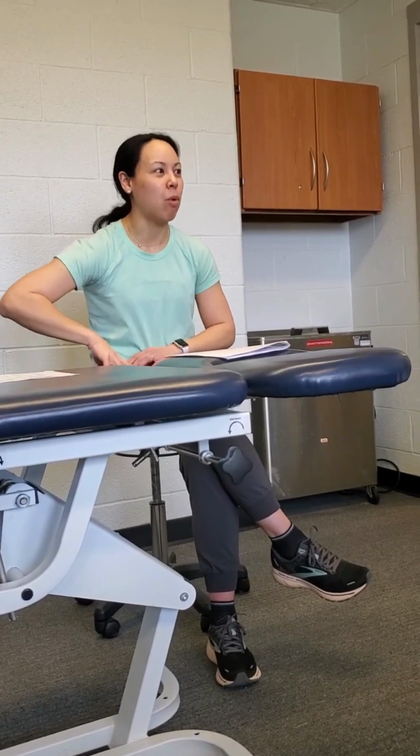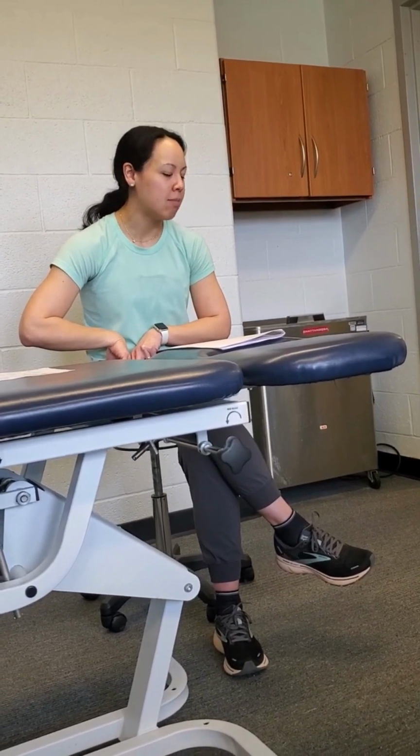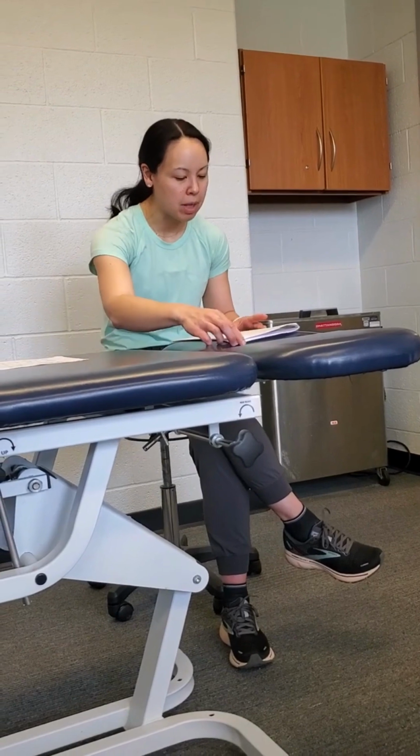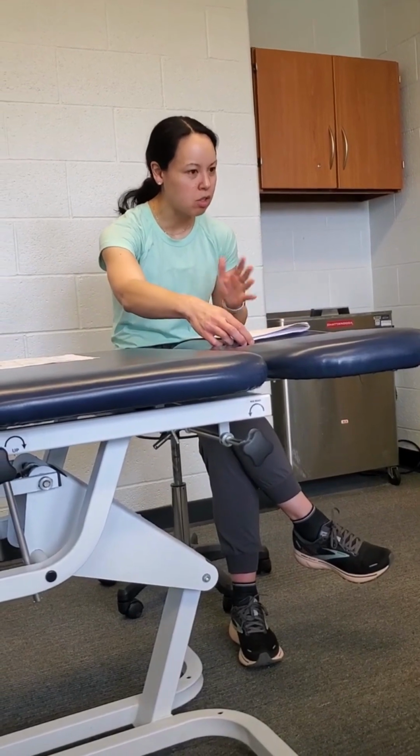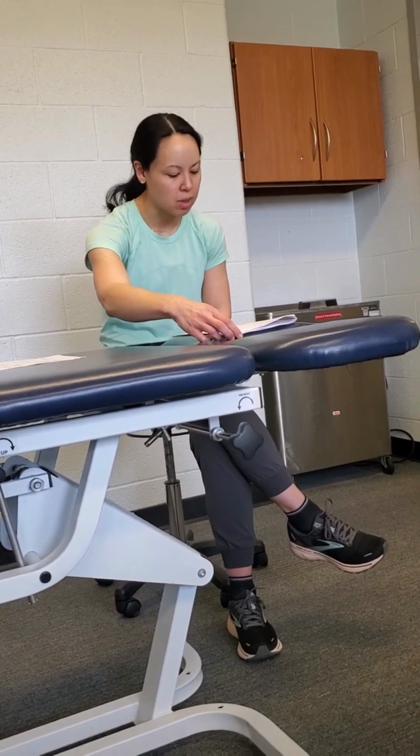These are obviously a lot wider, so they're going to be a little bit more comfortable, but I remember doing the lab, and you guys will feel it today, it's not super comfortable, and I think that's important to note to patients. It's not going to be comfortable, it should be tolerable, but it's going to be uncomfortable probably until they get used to it. The first session is usually the hardest one, and then the patients know what to expect in subsequent sessions.